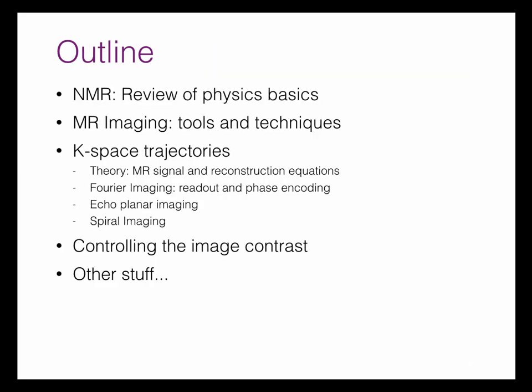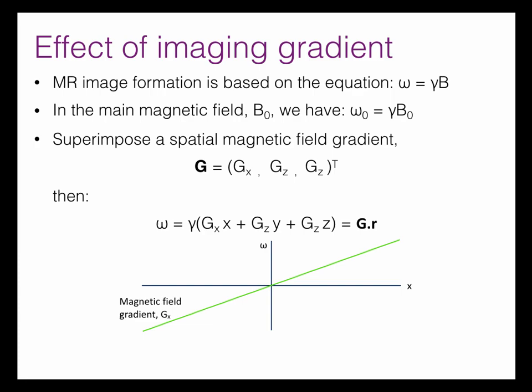Okay, so those are the basic tools that we'll be using to make our MR images. Now I'm going to go on to k-space trajectories, because this is basically a general approach to MR imaging.